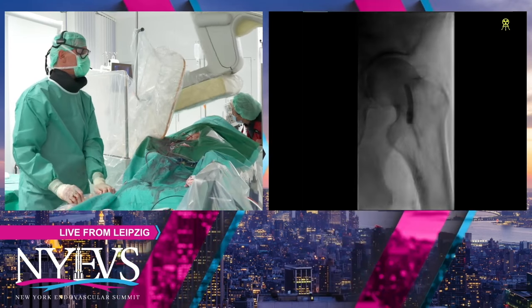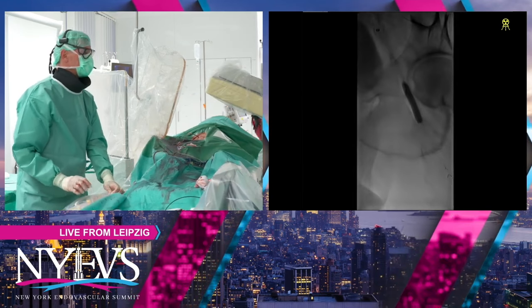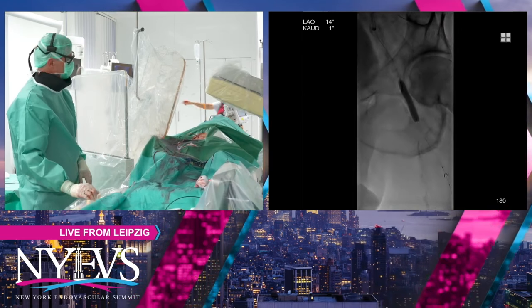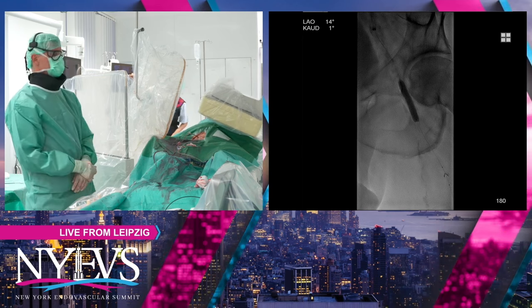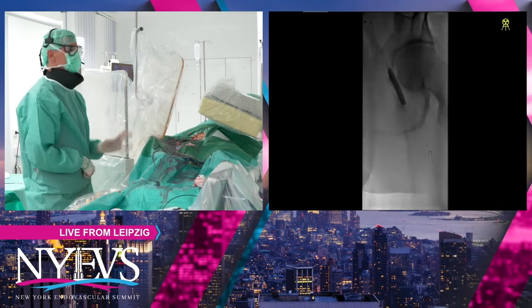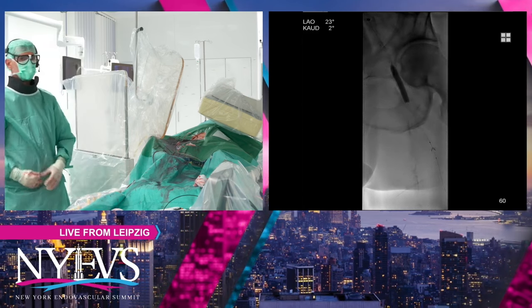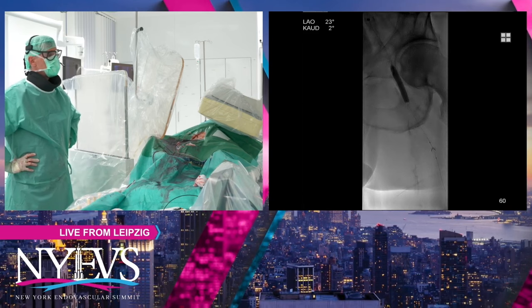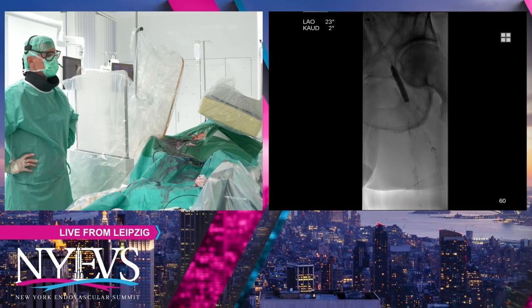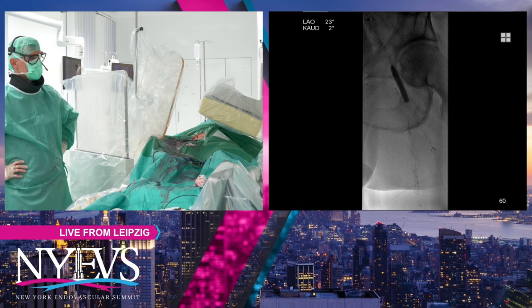What sometimes helps is you can take a coronary guide, like I use a 7 French multi-purpose guide, bring it on top, and try to suck it out using a big syringe. If it doesn't work, connect Penumbra and go forward and suck all this out before you pull the actual filter. Otherwise, if you just try to pull this filter out, it's just going to spill. The whole thing is going to fly down, and it simply won't be able to accommodate back.